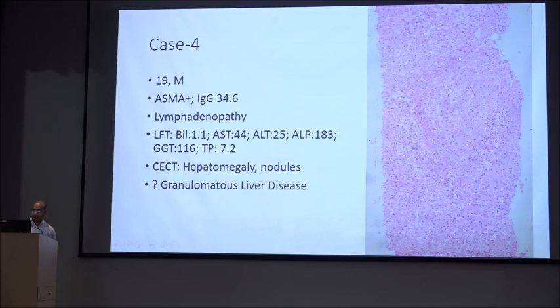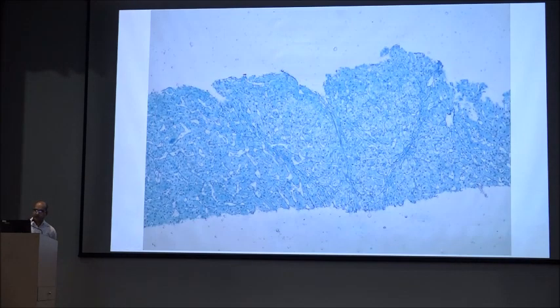There is some nodule kind of formation. Here you can see normal hepatocytes. These are relatively light stained, and this is a structure which is showing a bit dark stained hepatocytes. So the dark stained areas are showing compressed hepatocyte cord with reticulin condensation here, and here also these are other structures which are showing similar kind of morphology, and they are creating the small size nodules.